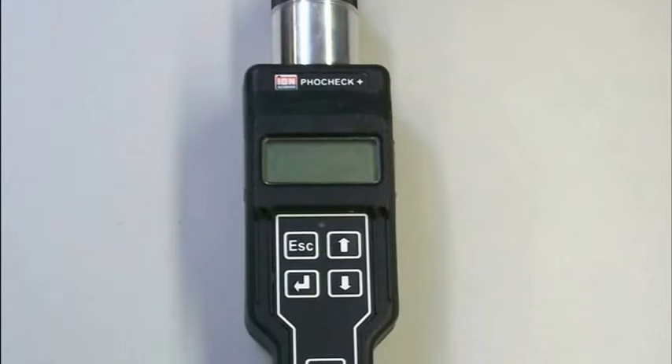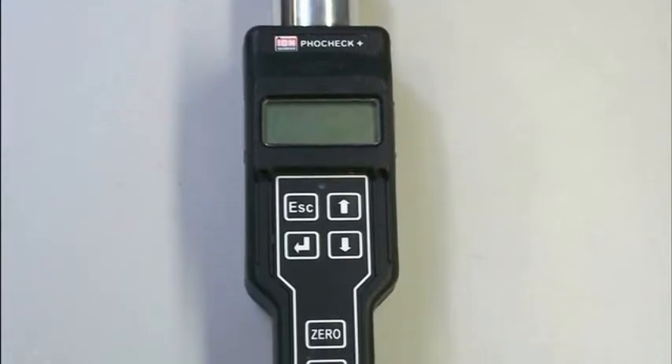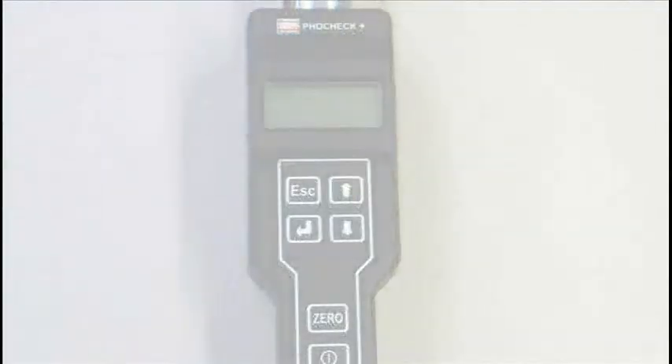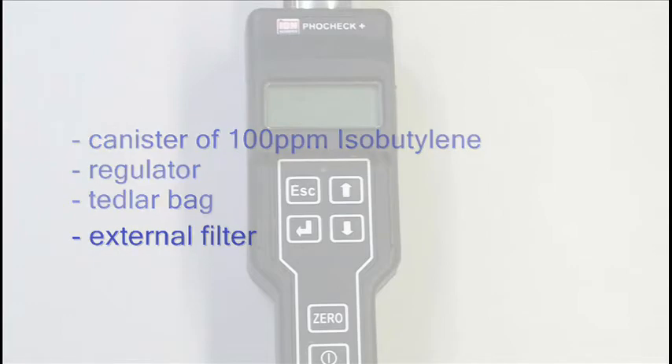It features real-time readings, data logging capability, and the fence electrode which suppresses high humidity inside the PID. For calibration, we will need the following supplies: a canister of isobutylene at a concentration of 100 ppm, a regulator, and a Tedlar bag. Please remember to always use an external filter whenever using a PID.